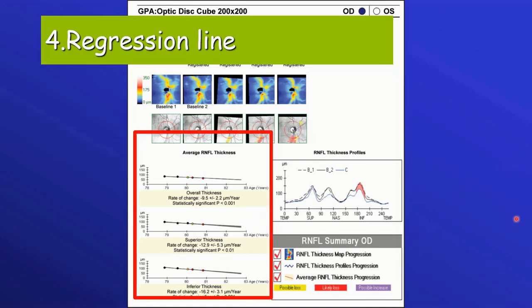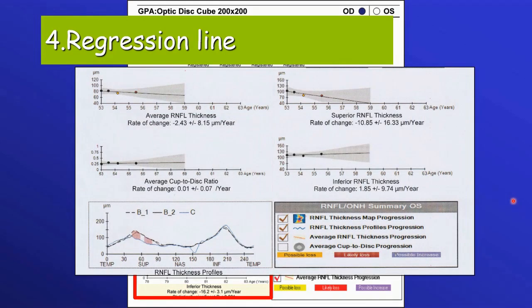Lastly, for progression there is a regression line plot. Here is an example of the regression line for the whole thickness of the retinal fiber layer, for the superior half, and for the inferior half. In another printout, you can see the whole thickness, the superior retinal fiber layer, the inferior retinal fiber layer, and the cup description. B1 and B2 are the two baseline tests; C is the current test shown in blue. You can see that in the superior circumference, comparing to the baseline, there are changes occurring twice, so the mark appears in red.